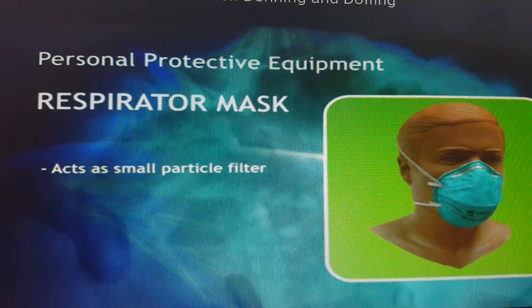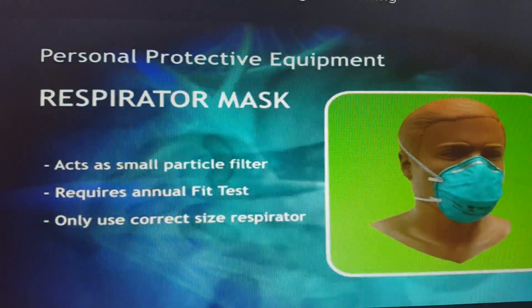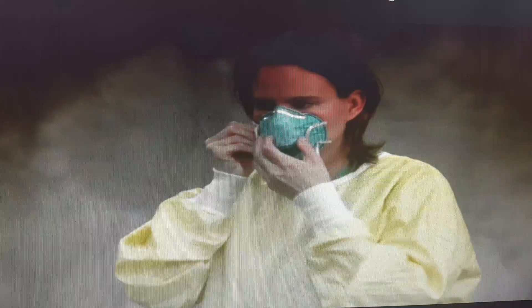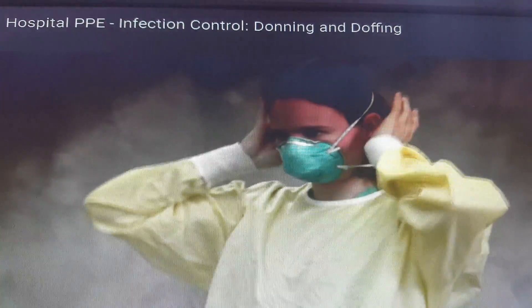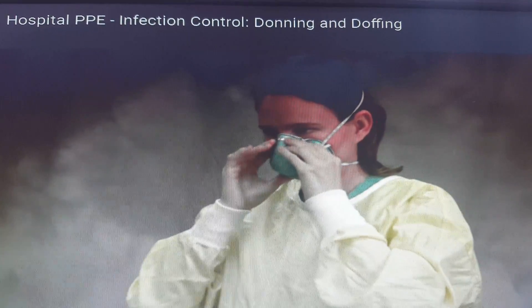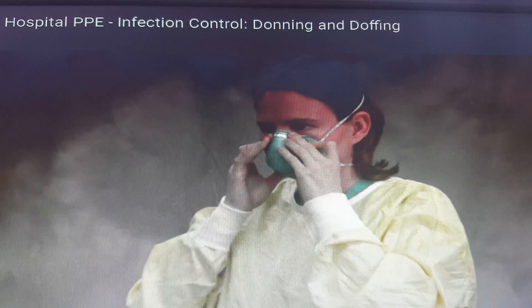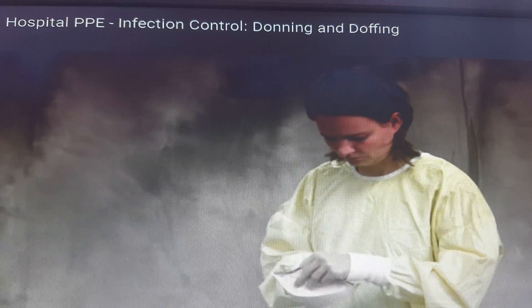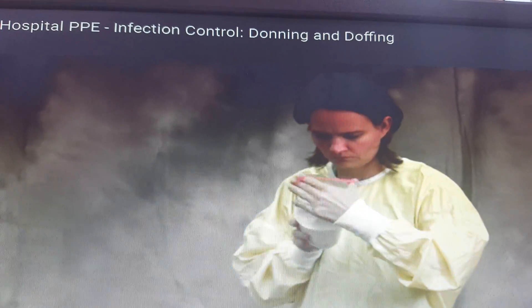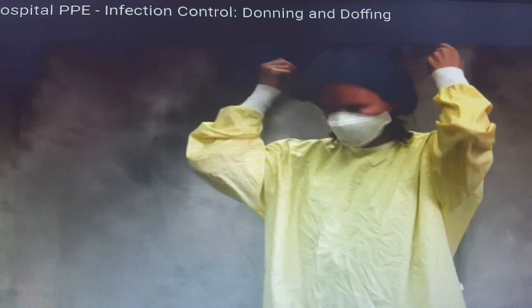For small particles, wear the N95 mask, and you need to do an annual fit test because you must wear the correct size of N95. The fit test checks which of the three types of N95 fits you. Press the metal up and take a breath, pushing air out to check for leaking. If there is leaking, the mask is not suitable for you. The fit test is done with the infection control practitioner, and you receive a card that is updated annually.